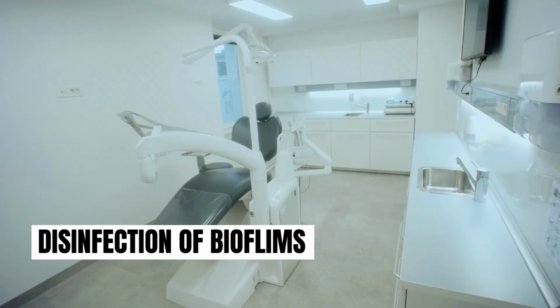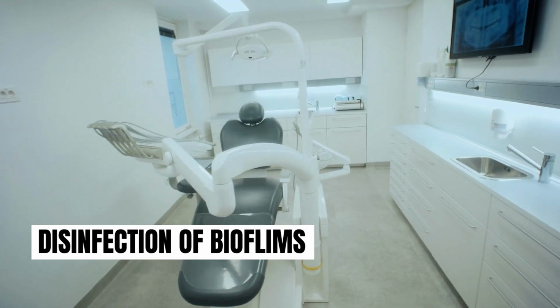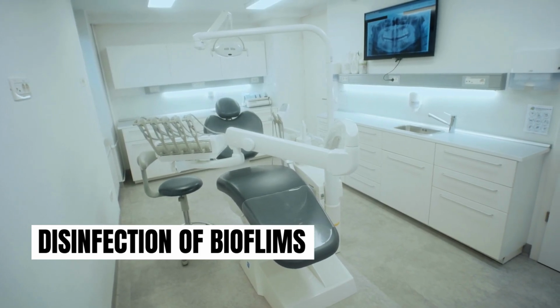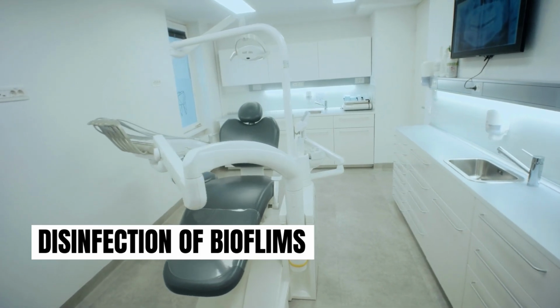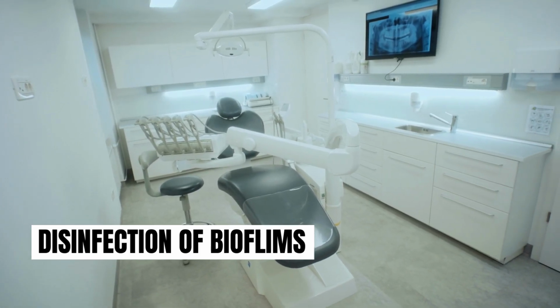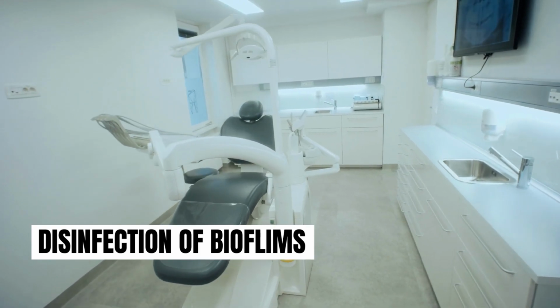Studies suggested there is a high risk of transmission of HIV from dental personnel to the patient and from patient to patient. Studies reveal that bacterial biofilms were found on the inner walls of the plastic tubing supplying water to constituents of the dental unit using scanning electron microscopy. These biofilms could be found in any tubing that supplies water to the dental unit.